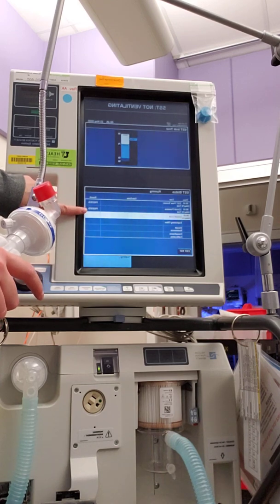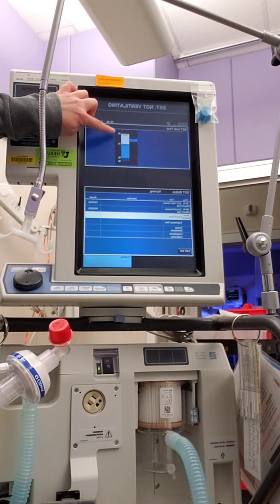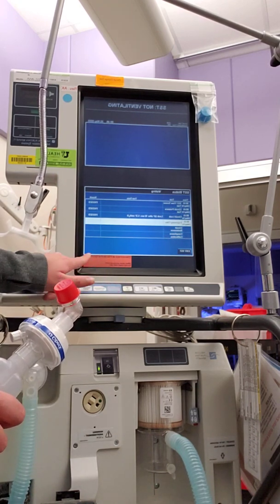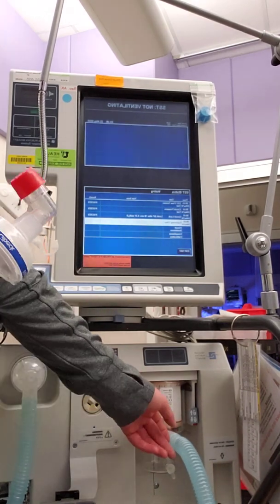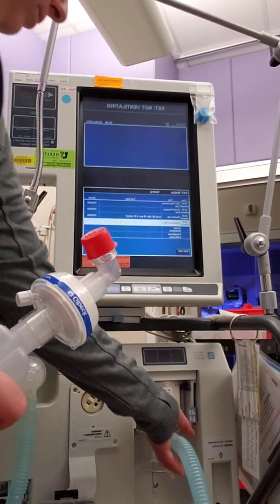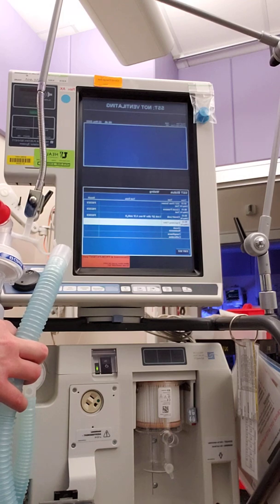Next we're going to check circuit leak. This is all while we're blocked. It will show you whether we're in a pass, alert, or fail. Okay, so disconnect from patient port. We're going to check the expiratory filter. So we disconnect from the patient. So we take it off the expiratory filter and then press accept.